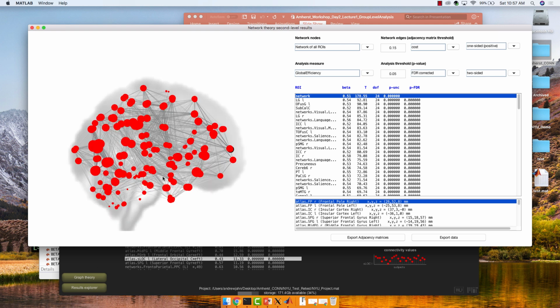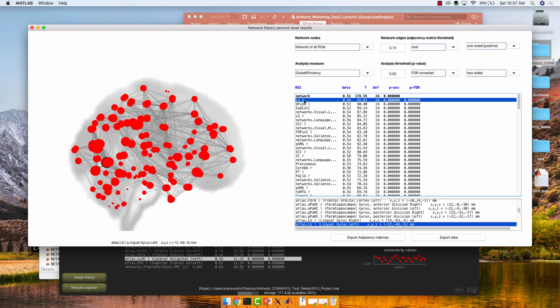So if you wanted to get how they're all interconnected to each other, not from one seed, how would you do that? How they're all interconnected to each other. Is that what this is? Am I misunderstanding? That was what you did before. Okay. Yeah.